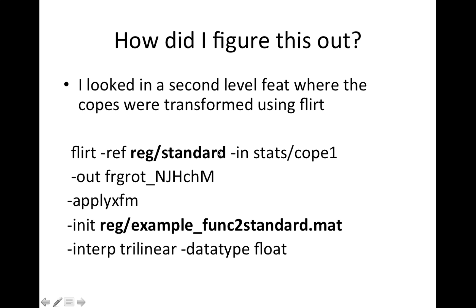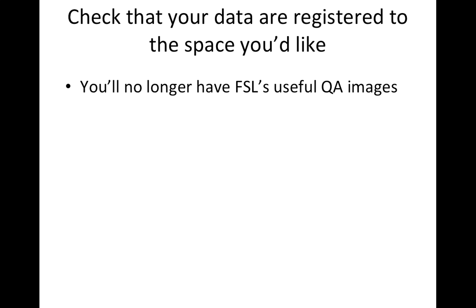These are the only two things we need to fix. We're going to run our level one analysis as usual, then overwrite these two files in the reg directory. We'll change the standard image to be what we want — if you're using fMRIPrep it won't be the MNI template exactly, because it retains the same voxel dimensions as the original data but moves it into standard space. We need to replace the .mat file with an identity matrix, which will not move the image at all.